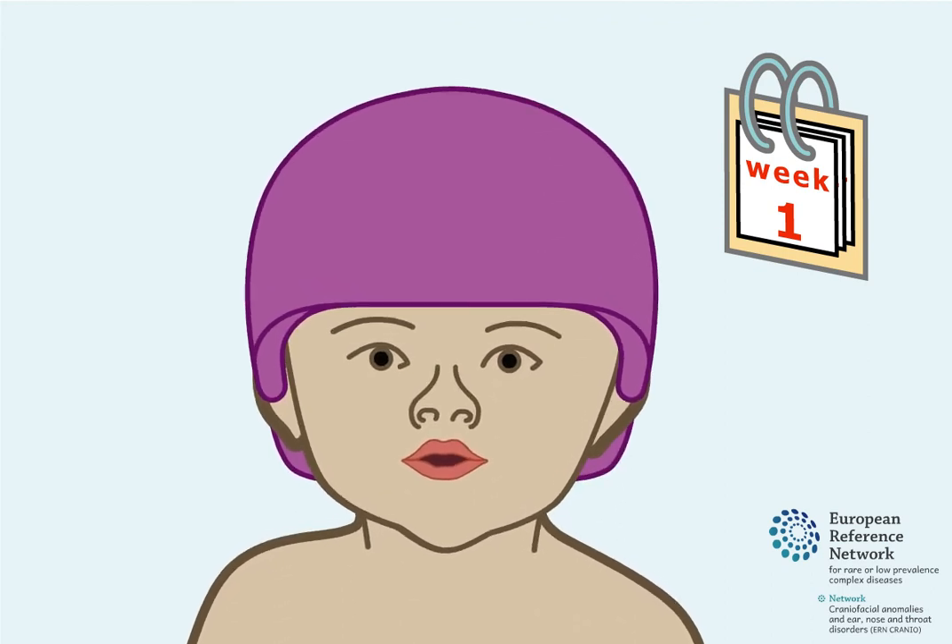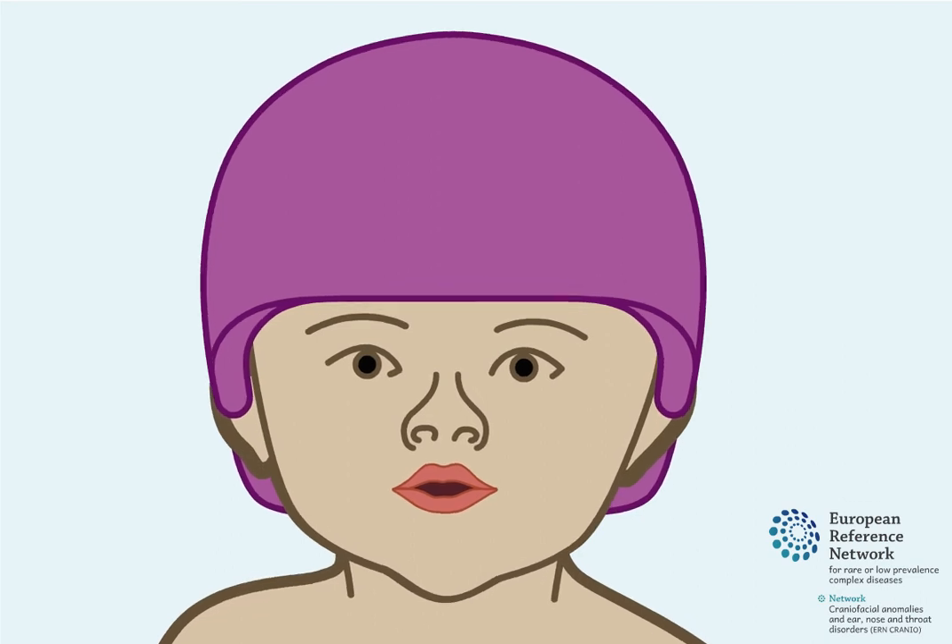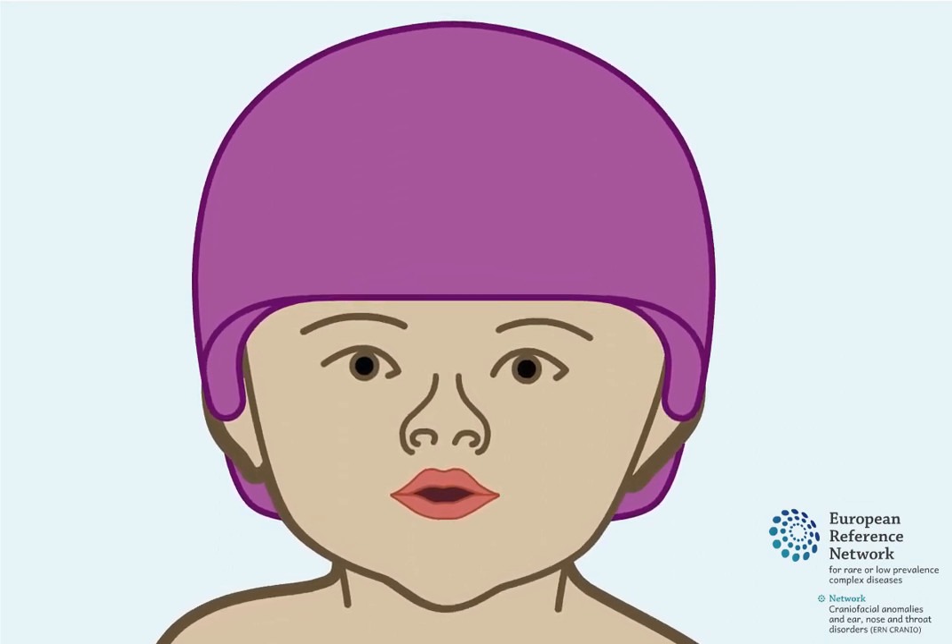Approximately one to two weeks after surgery, children will start helmet moulding therapy. This lasts several months and is used to help guide skull growth.